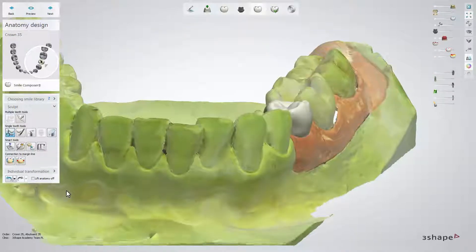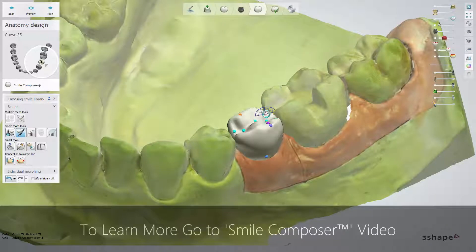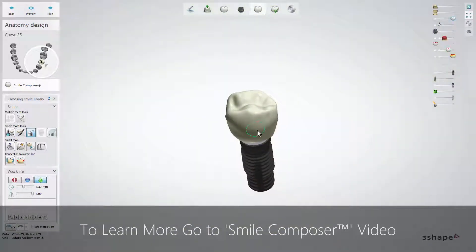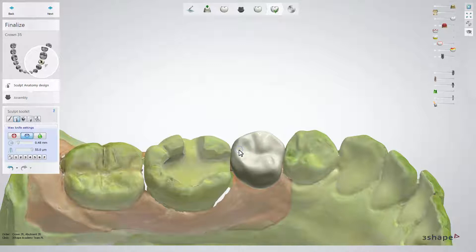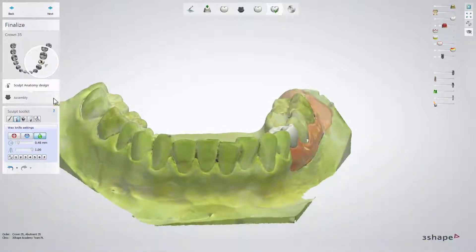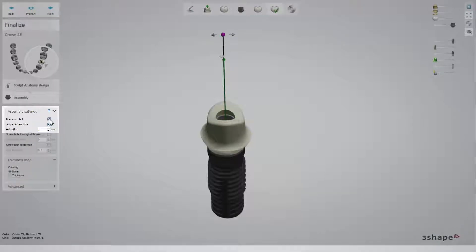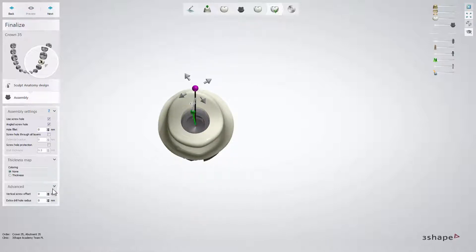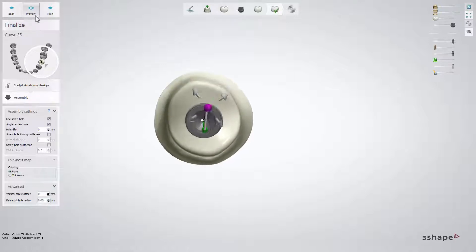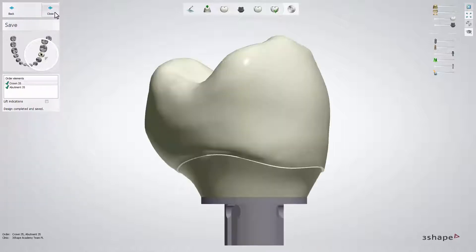When you click Next once again, you will enter Smile Composer. This step allows you to correct the anatomy design using sculpting tools and libraries. When done, click Next to get to the finalized step, where you have the possibility to make final adjustments to the design of the crown and assembly of the abutment. In the assembly settings, you can activate the screw hole as well as screw hole angulation. If you change the angulation of the hole, you may want to add extra drill hole radius to keep enough space for the screw. When finished, click Next to get to Save and Close.